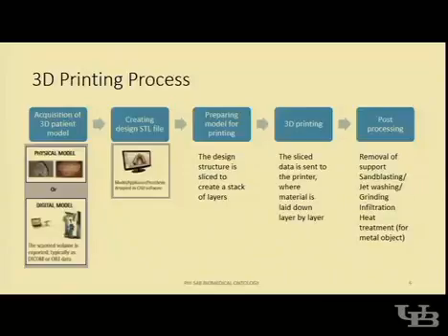First, it starts with the acquisition of the 3D patient model, which is the tooth model or jaw model. This model could be a physical model, maybe made with clay, or a digital model from the scanner. From this model, they will create the STL file, which is the stereolithography file.